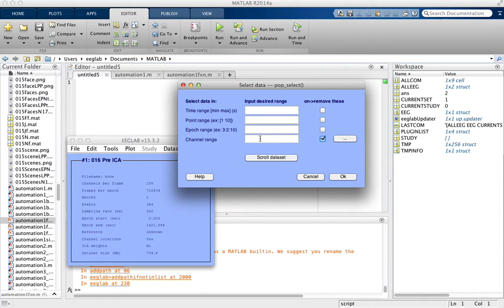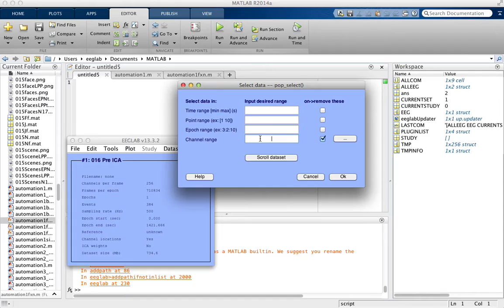So if we check this box, it'll remove the channels that we type in here. If we don't check that box, then it'll only keep the channels that we enter in this box here.